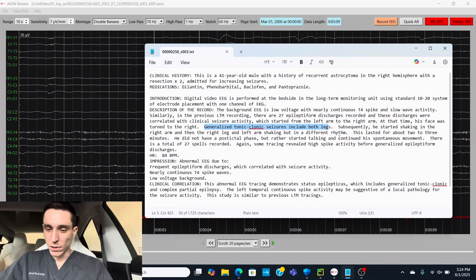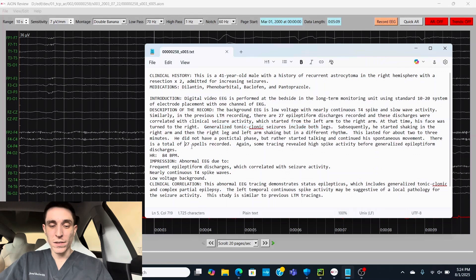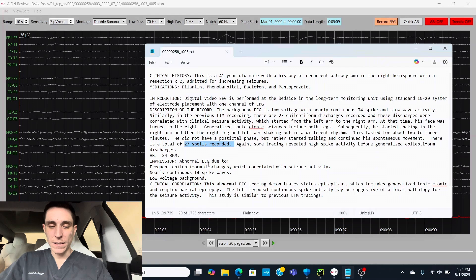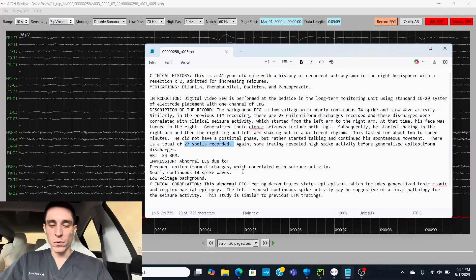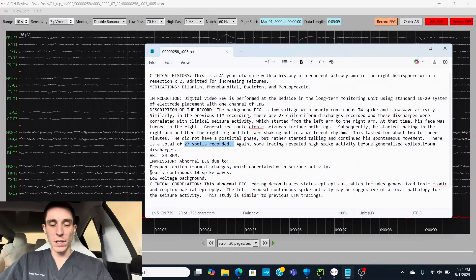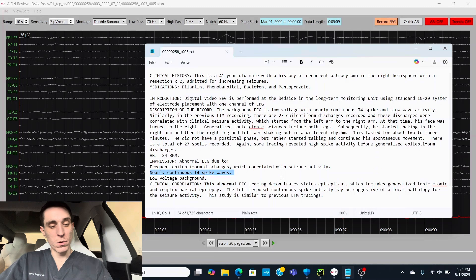So it looks like a total of 27 spells. So yeah, this is a serious case. And let's see. Abnormal EEG due to frequent epileptiform discharges, which correlated with seizure activity. Nearly continuous T4 spike wave. So we're going to go through and check that out.